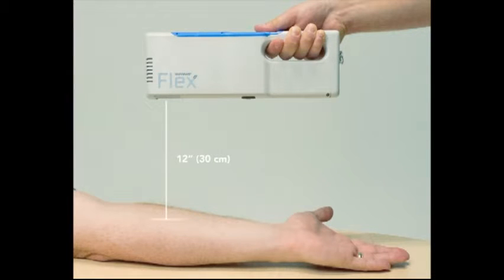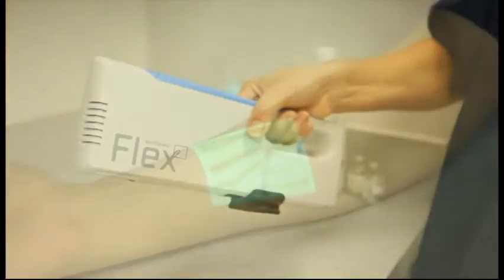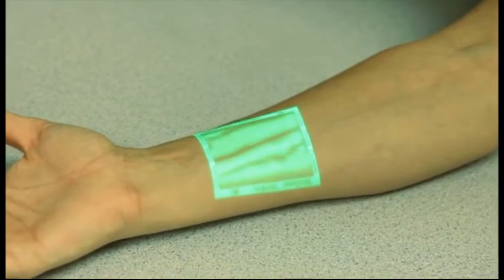Flex should also be held as close to perpendicular or 90 degrees to the surface of the skin as possible. Once perpendicular, rotate the device in any horizontal orientation and maintain image quality.